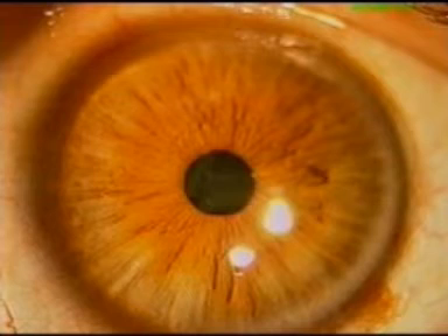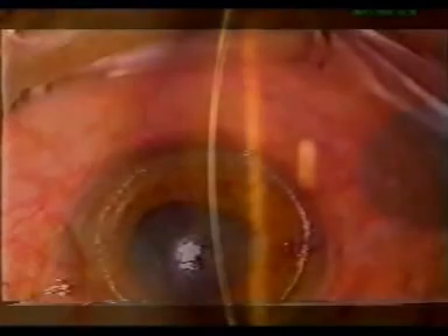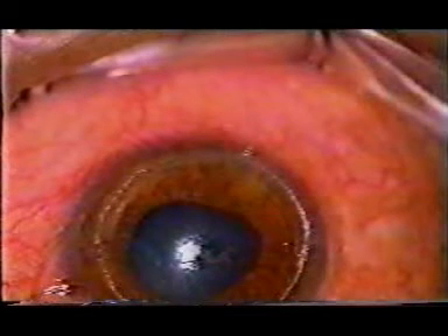A 40-year-old male with bilateral keratoglobus was taken up for this surgery in the right eye. A corneal trephine of 8.5 millimetres was centred and used to make an initial partial thickness groove of approximately 200 microns.